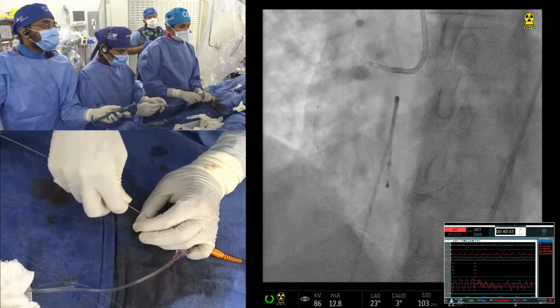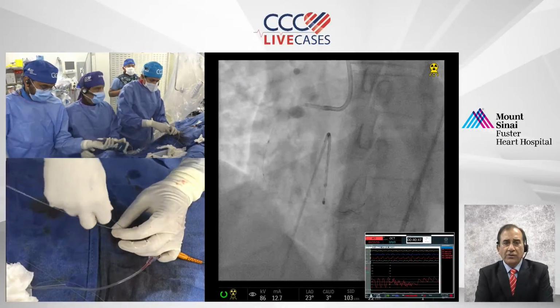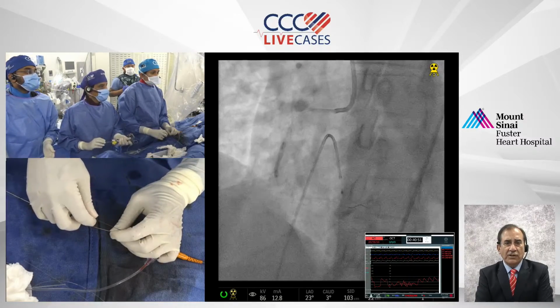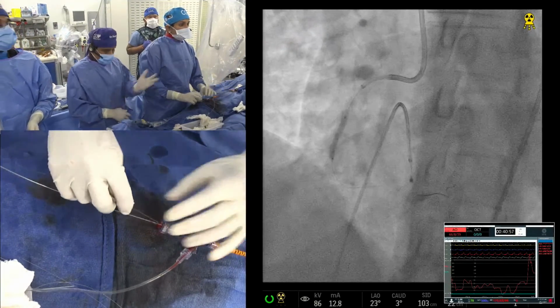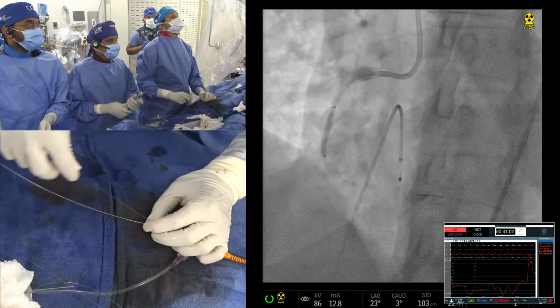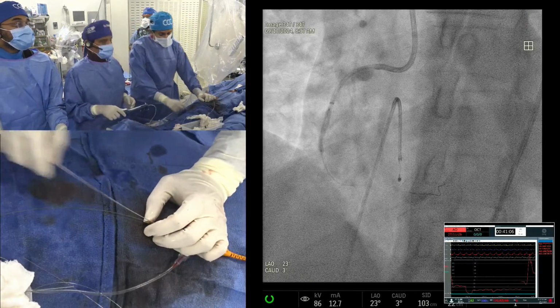So Samin, a very excellent question has come in. If you were to use a single plaque modification strategy, what would the approach be? Rota, period. That's it. This is the case for rotational atherectomy. Nothing else will go. You saw that OCT didn't go, also based on the quantification and the quadrant calcification. It was not going.